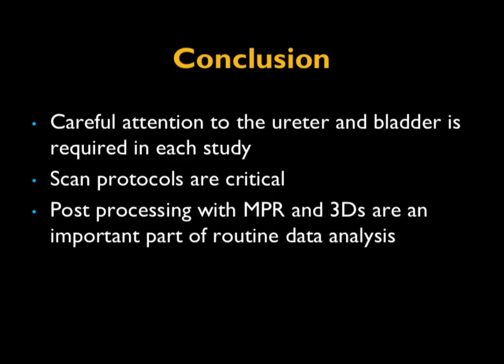So with that, I'll conclude. Make sure to remember the importance of looking carefully at the ureter and bladder. They will significantly underperform imaging if you do not pay a lot of attention to technique, both in terms of data acquisition and in terms of interpretation. If you're not careful, it's very easy to miss these lesions, and the miss rate is indeed very high, particularly early on. We mentioned the importance of scan protocols and post-processing. I think post-processing ends up being driven by applications that are very demanding, and this is one of the applications.